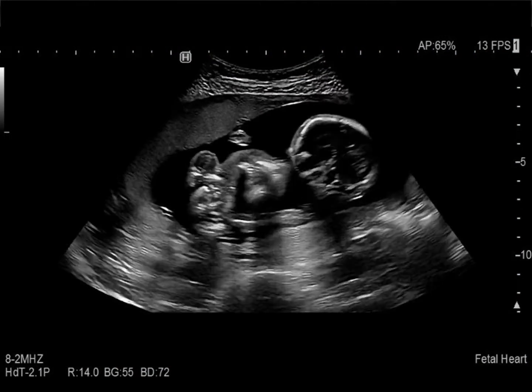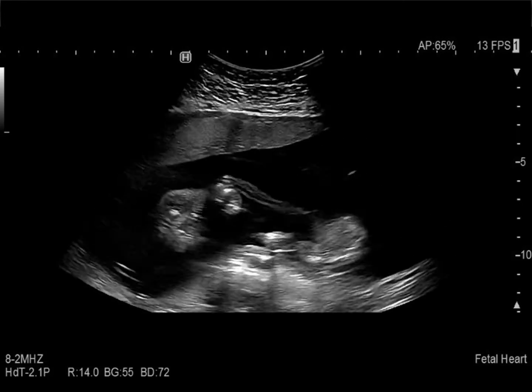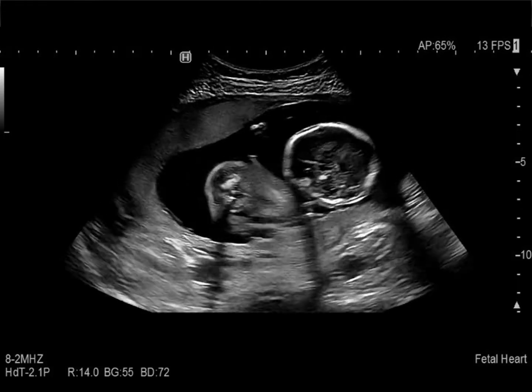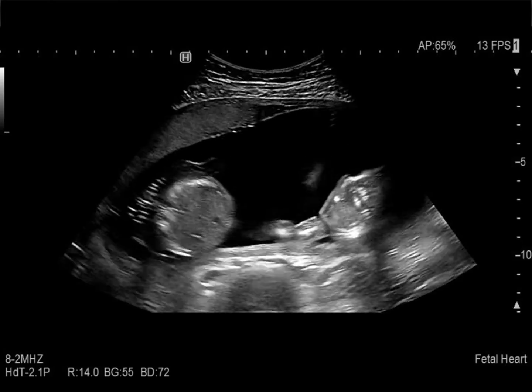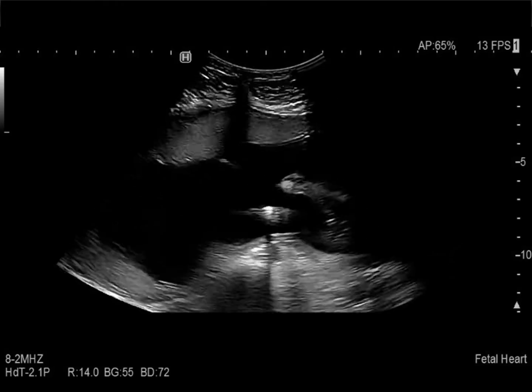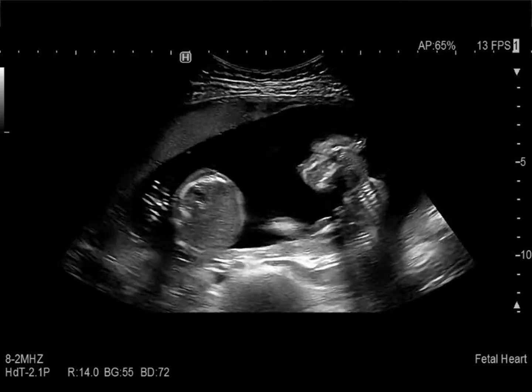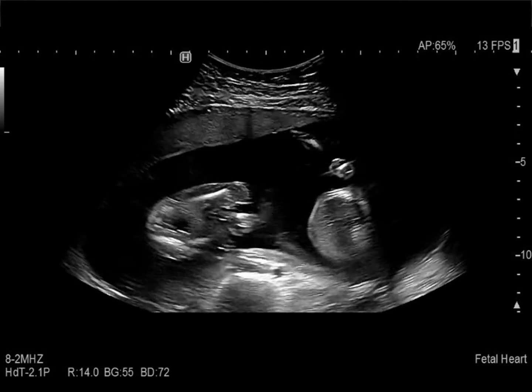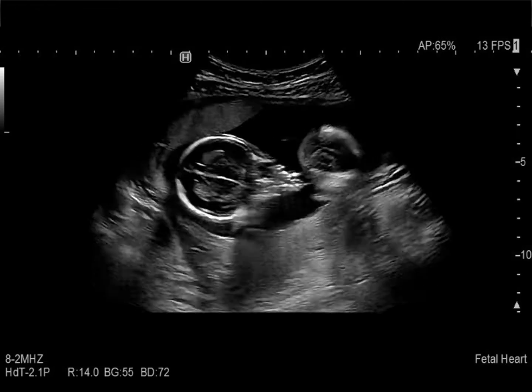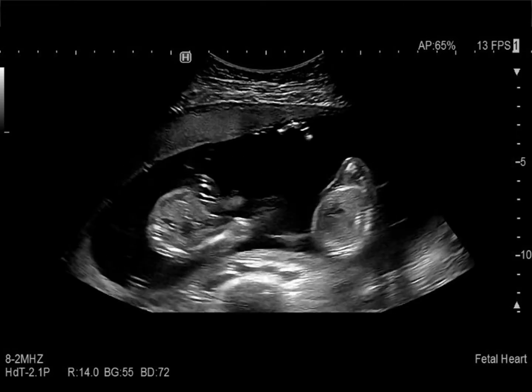And this is an example of that. This is a transverse abdominal sweep, fundal sweep from near the cervix, where you see very little of the amnion, and we sweep cephalad on the maternal abdomen. You can see this is a monochorionic, monoamniotic twin pregnancy, and both twins are cephalic. First thing you see are the fetal heads. The placenta has anterior and right lateral components, and you can clearly see that there is not a membrane separating these fetuses.